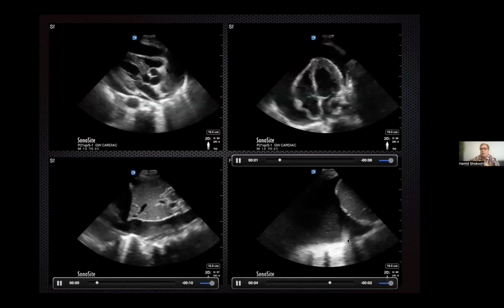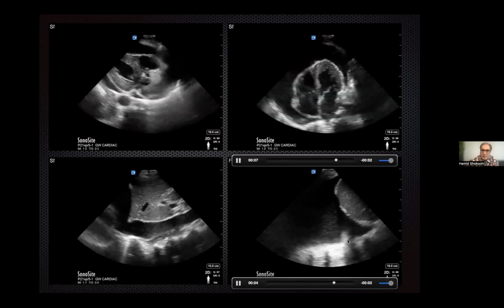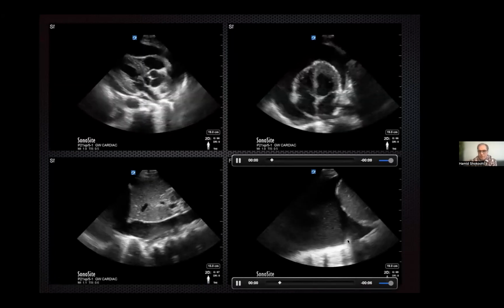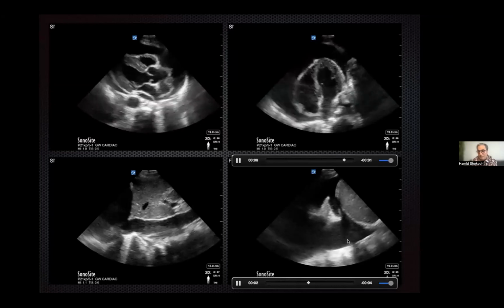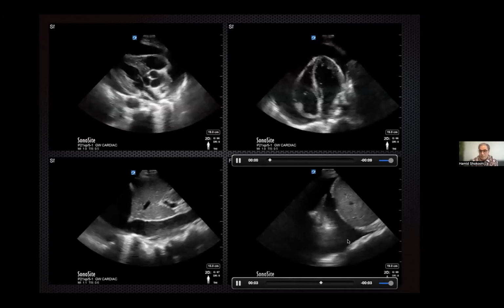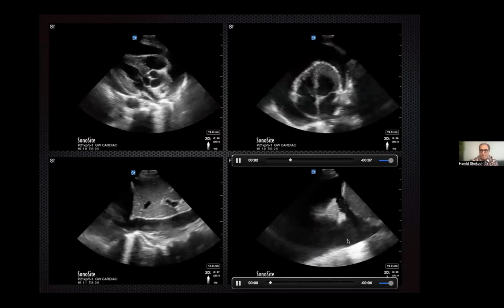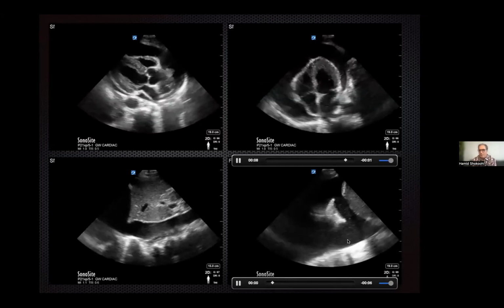So you are seeing that what we've been thinking about the X-ray is obviously correct. Two things come to your mind. This patient has a history of colon cancer. Is it possible this patient has PE? Clearly, this patient has this large effusion. This patient is suffering from atelectasis. Yes. And why is the RV not collapsing?